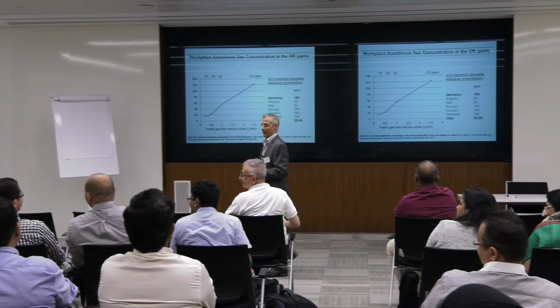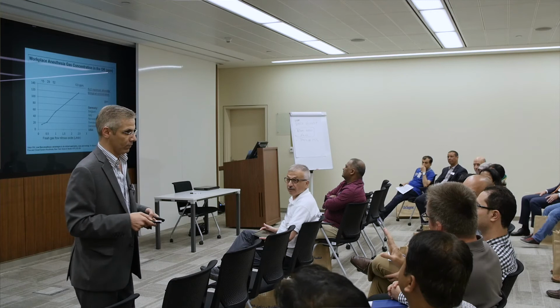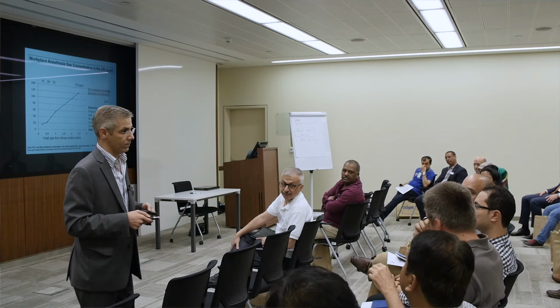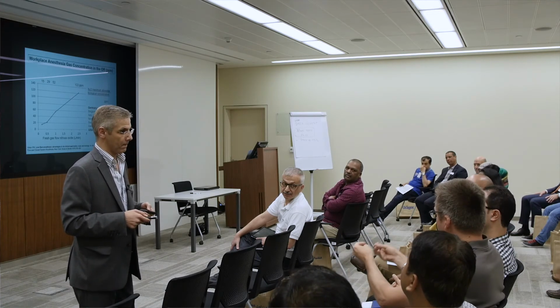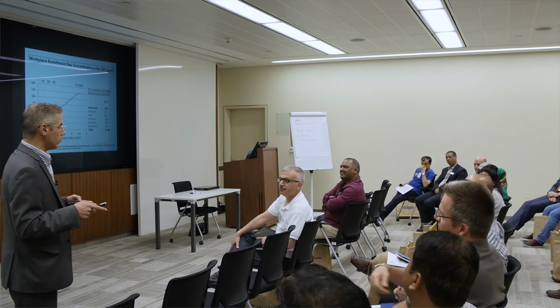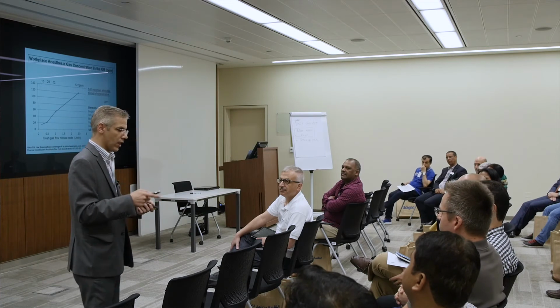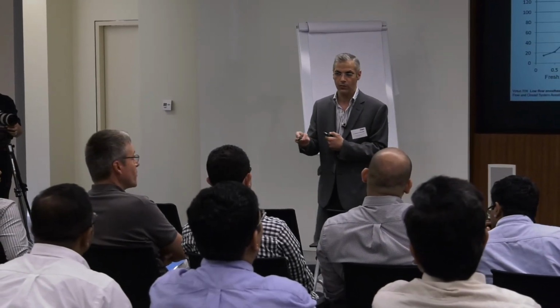Sure, sir. Only as feedback, N2O is eliminated in most of the hospitals. We don't use it anymore since many years, because our management and the biomedical people told us it's too expensive to maintain. You have many leakages, you lose a lot of these gases technically before using it as a medical gas. So 10, 15 years ago in my hospital and in many other hospitals, we eliminated them totally. They are still available, you have these plugs, but they don't work. They are off. Yes, in some countries in the Middle East also, they eliminated using it for safety reasons, like what happened in Egypt, I think. But it's not yet the routine all over Europe and the USA.